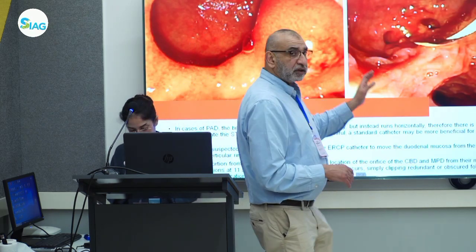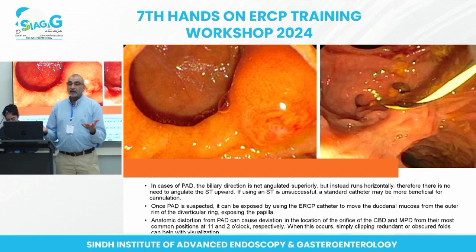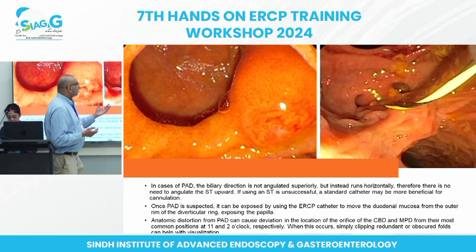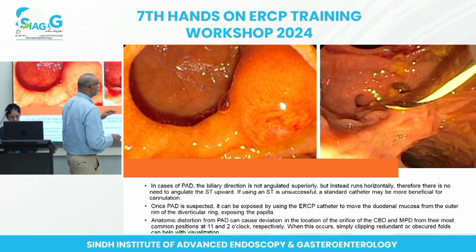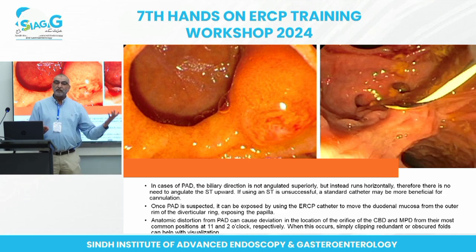Briefly about diverticulum. They are always a nuisance for an endoscopy, adding extra challenge. It's not such a problem if your papilla is on the edge of the diverticulum. ठीक है, जैसे यहाँ पे है ना, ठीक है. They are easily, cannulation काफी straightforward होती है.